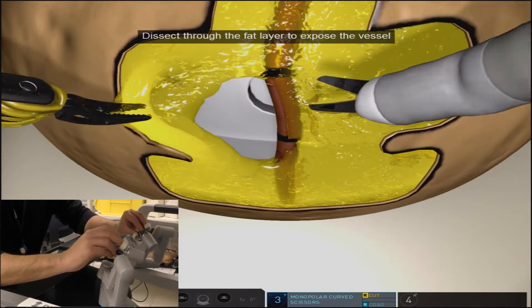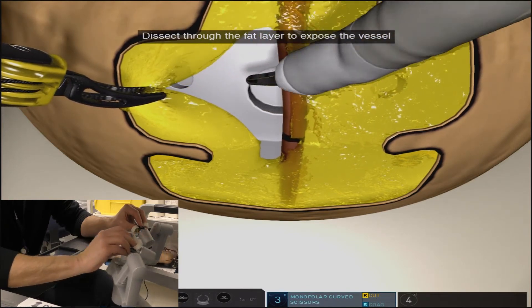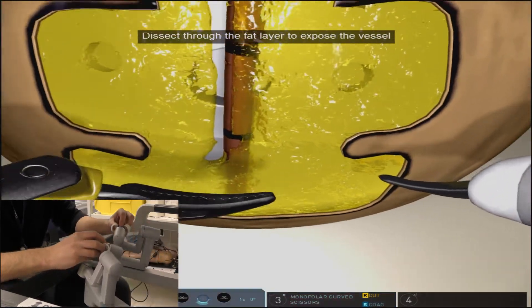You can use your left hand grasper to grab the fatty tissue and create tension which allows you to more easily dissect out the sides of the vessel wall.